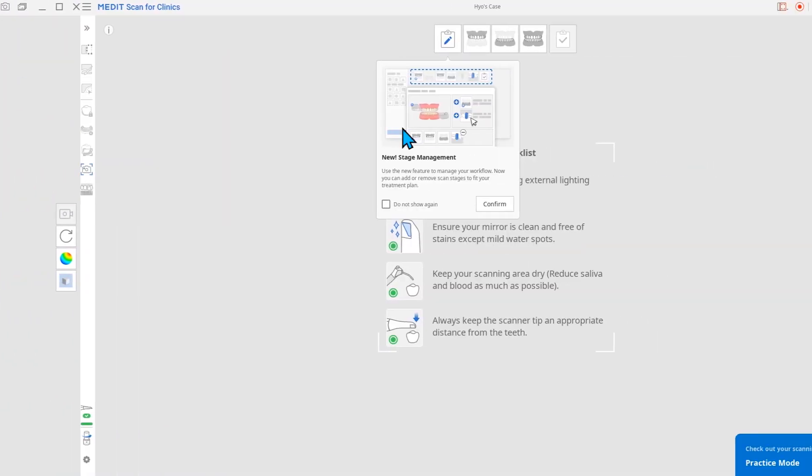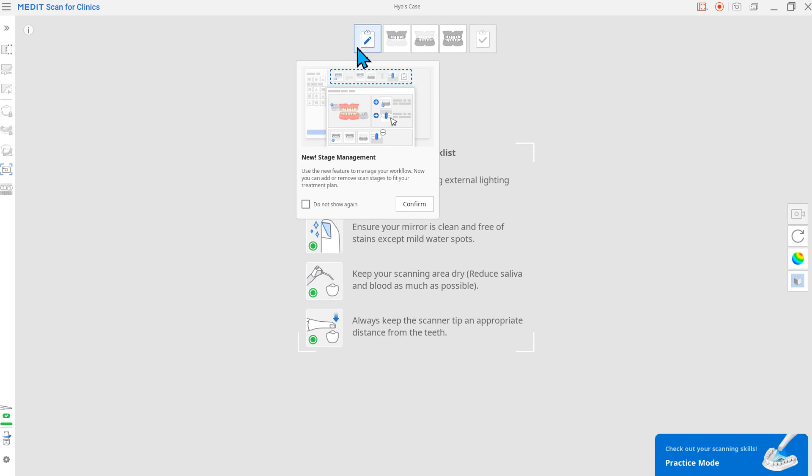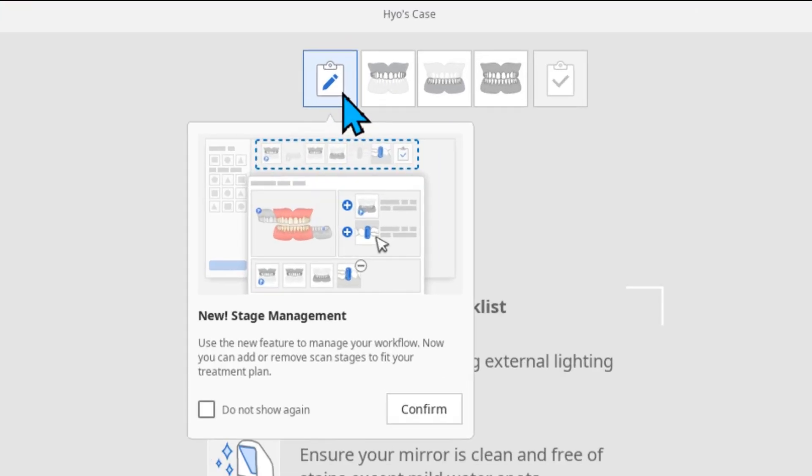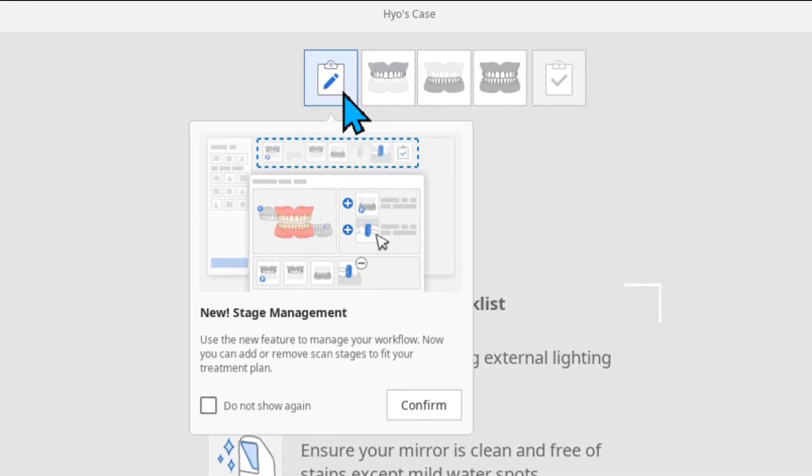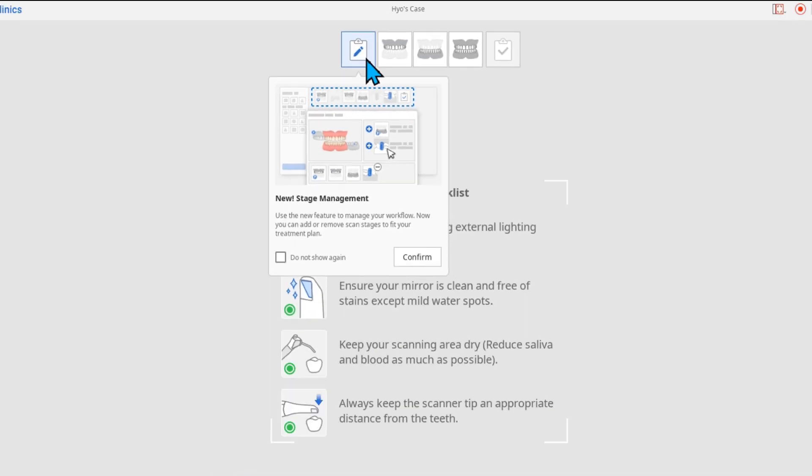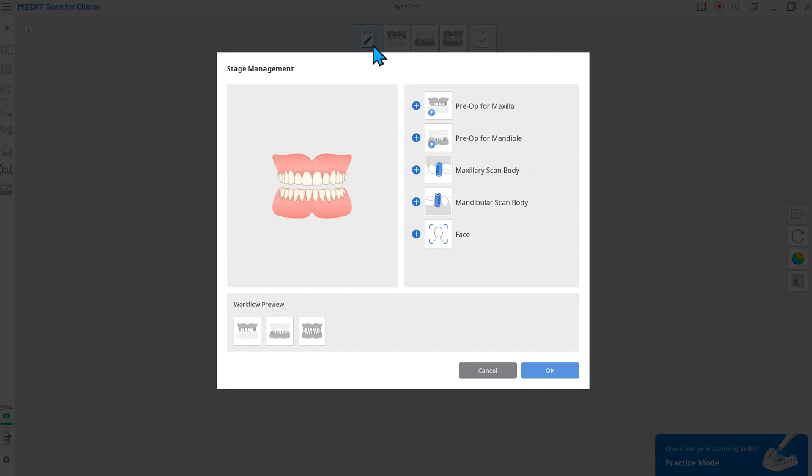Now, you can easily manage your scanning workflow directly in Medit Scan for Clinics. Use the stage management feature to add or remove scan stages or change their order in the workflow preview.